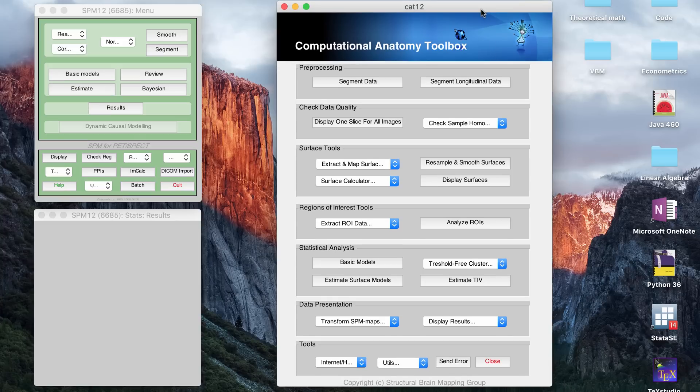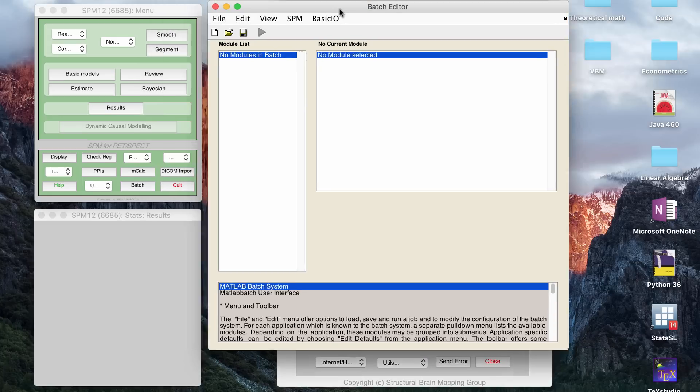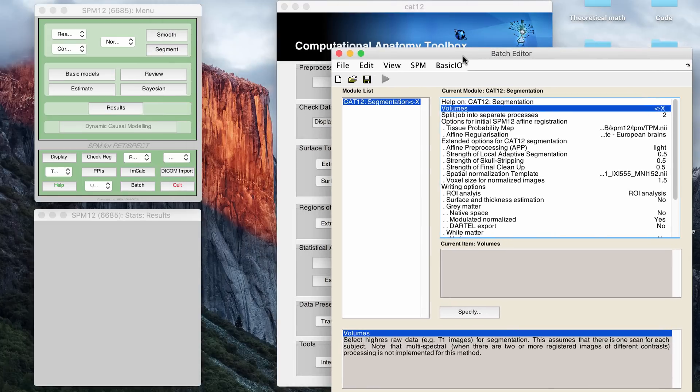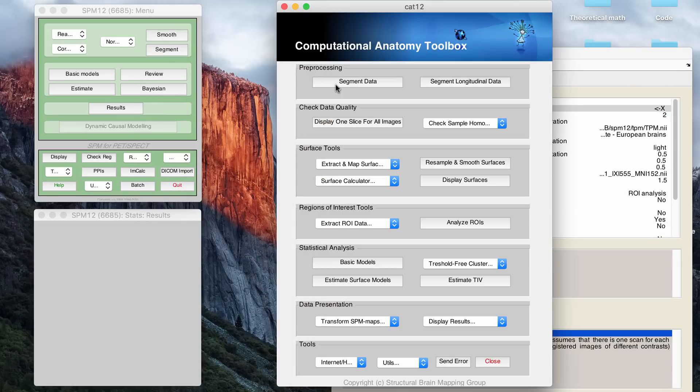Okay, so the first thing you want to do for VBM is to get, if your files are DICOMs, then you want to just convert them to NIFTIs, and then you want to segment your data. To segment the data, I go to the CAT12 segment button.